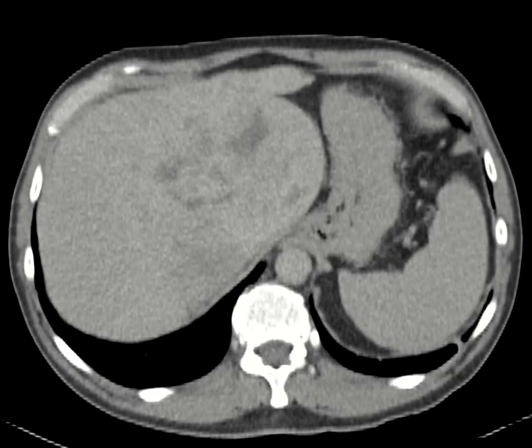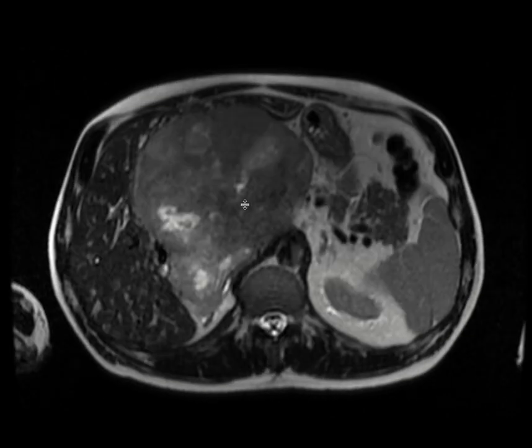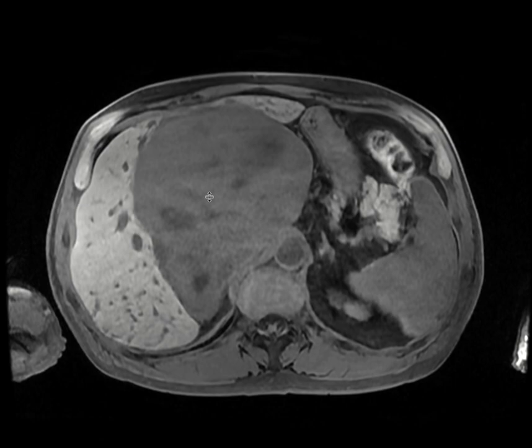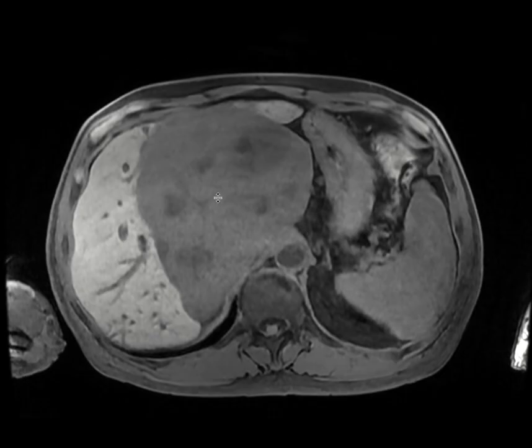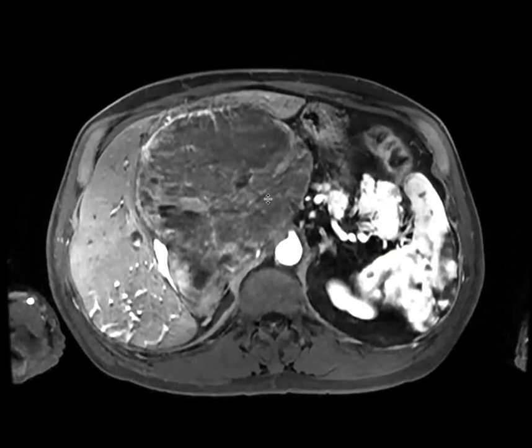Now on MRI, we can see on the T2 weighted images that it's got areas of low T2 signal, so it's hypointense, and areas of high T2 signal as well. On the T1 weighted image, here we can see that it is hypointense compared to the background liver. On the arterial phase, we can see that there's areas of enhancement, so this is arterially enhancing.